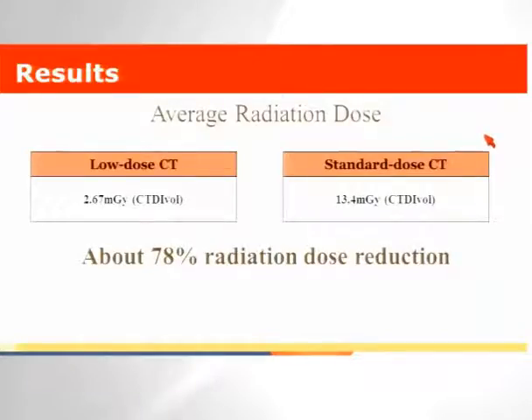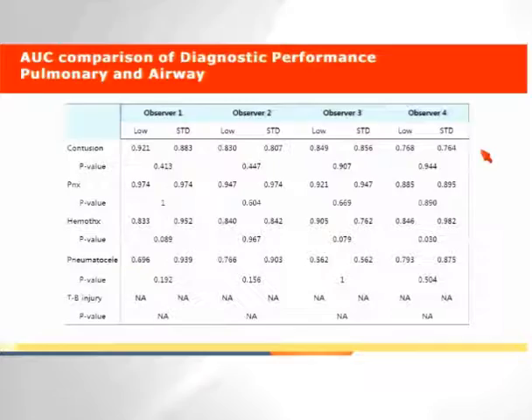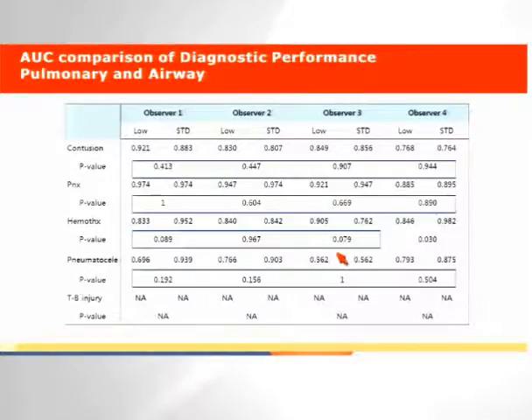Low dose CT scan showed about 78% radiation dose reduction.